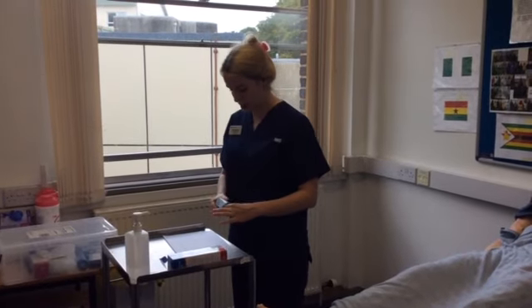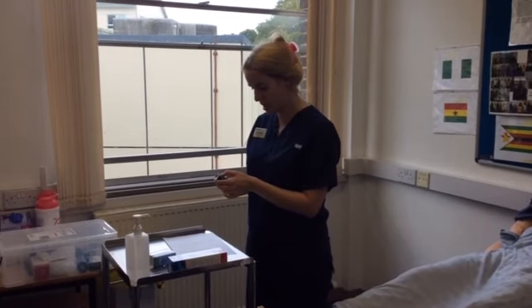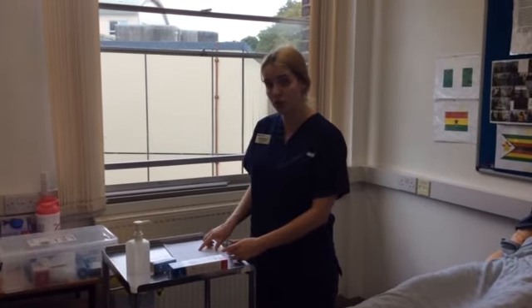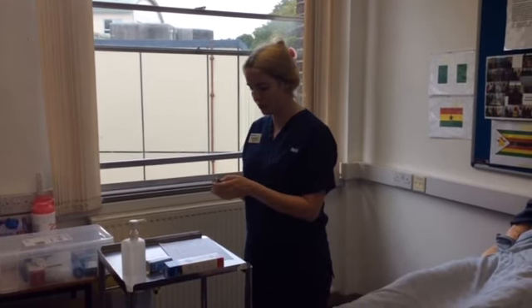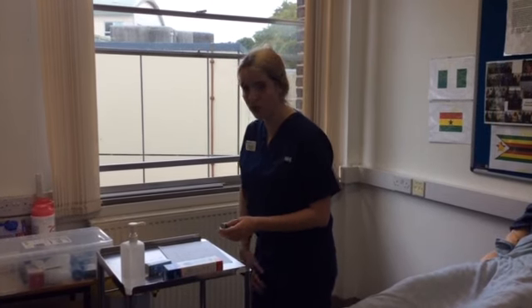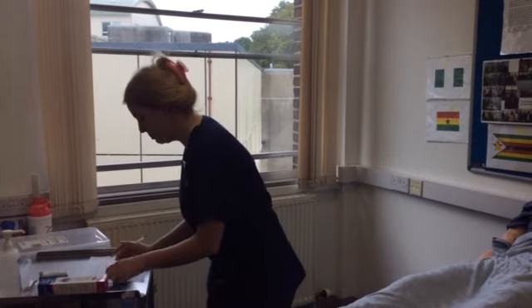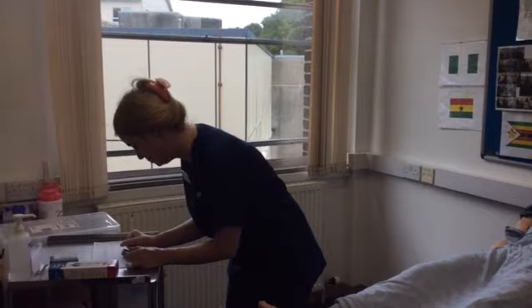So now to check my medication, here I've got the salbutamol inhaler, and I can see here that it's salbutamol, and it's 100 micrograms per inhalation. So as 200 micrograms is due, I'm going to give him 2 puffs. I'm also going to check the expiry date, which is 2022. Whilst I'm here, I will write down the batch number of my inhaler. Sorry, I just forgot my pen. I'll just write down the batch number now on my drug chart.